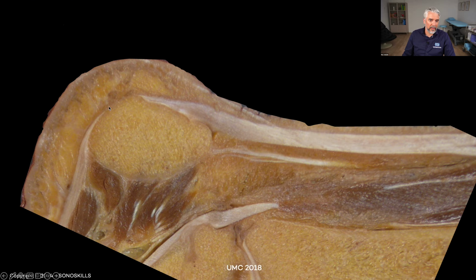Here we can see the Achilles tendon. There, again, we can see the origin of the insertion of the Achilles tendon. Then the Achilles tendon goes to proximal. In the depth, we can see Kager's fat pad, but also the retrocalcaneal bursa.